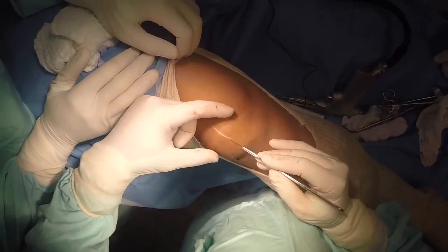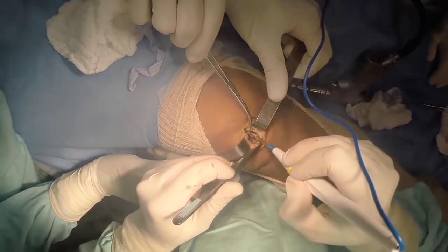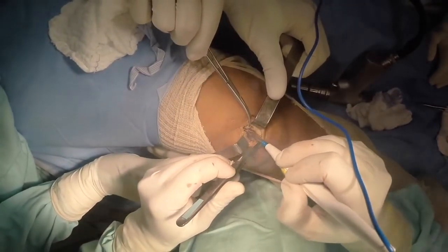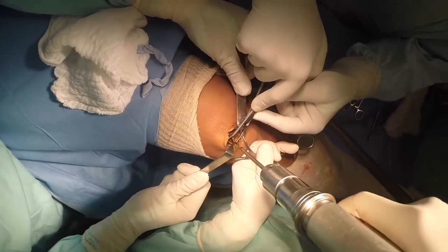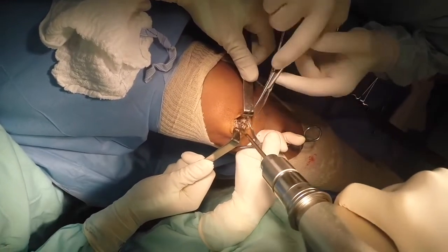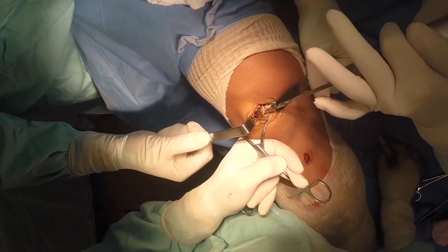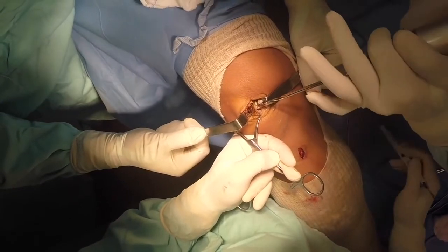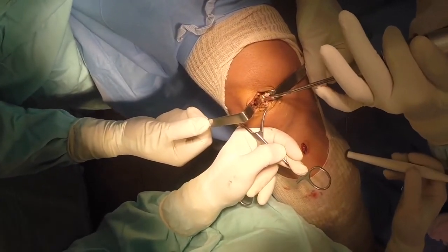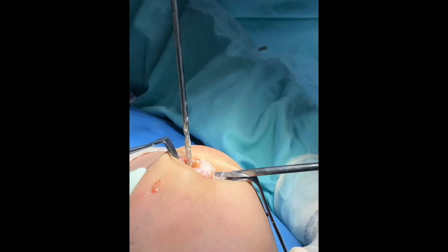Depending on graft size, a socket of 3.5 to 4.5 millimetres is drilled on the medial border of the patella at the junction of the upper and middle thirds, which is roughly the midpoint of the MPFL. This is then converted to a tunnel by drilling another socket of the same size perpendicular to the first on the anterior surface of the patella, one centimetre lateral to the medial border to ensure an adequate bone bridge.